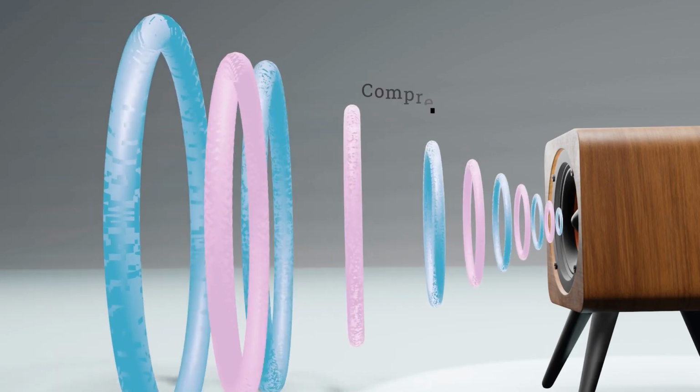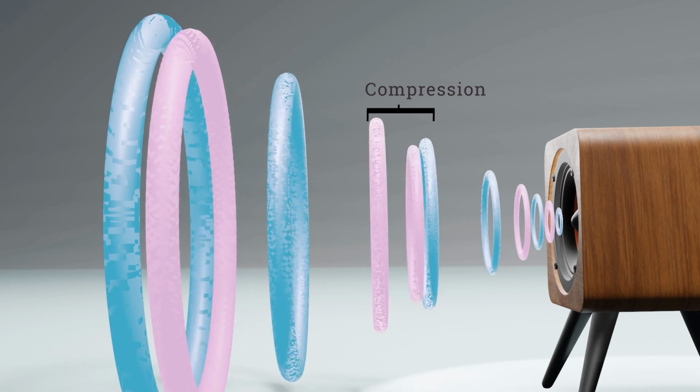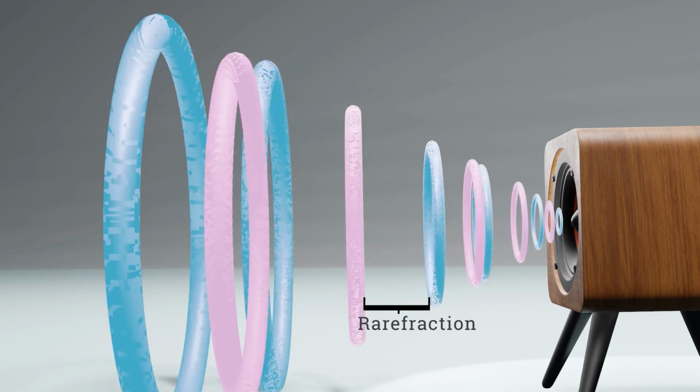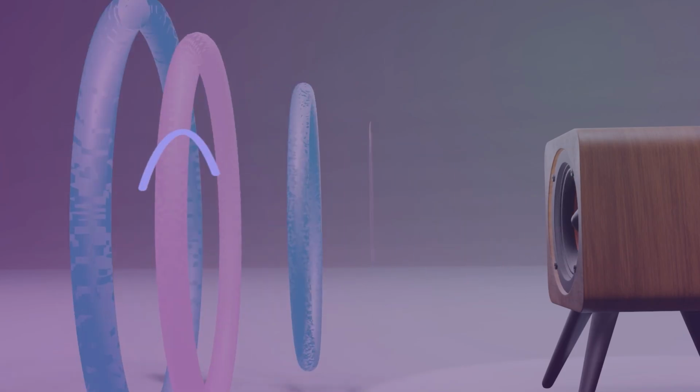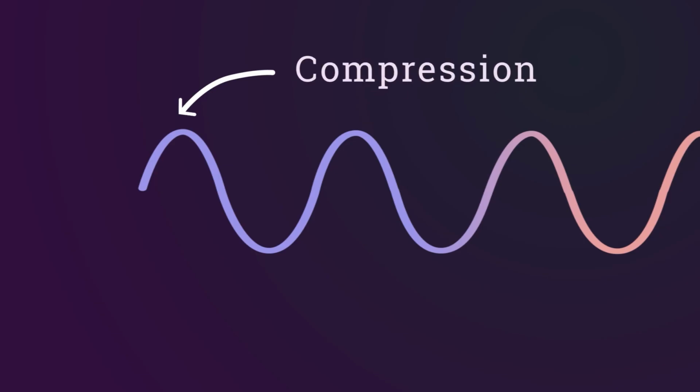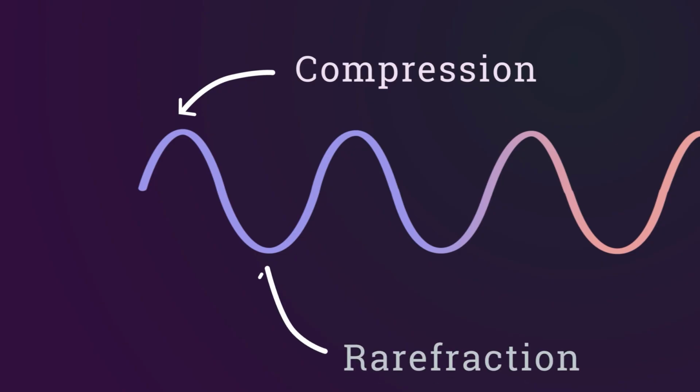When particles move forward, it compresses the air in front of it, creating a region of high pressure known as compression. When the vibrating object moves backwards, this creates a region of low pressure called rarefaction. The sound wave is graphically represented as a sinusoid wave, with areas of compression representing the upper part of the waveform and rarefactions being represented by the lower part of the curve, with low pressure regions. The maximum compression and density is located at the peak of the waveform, while the lowest pressure and density region is located at the trough of the waveform.